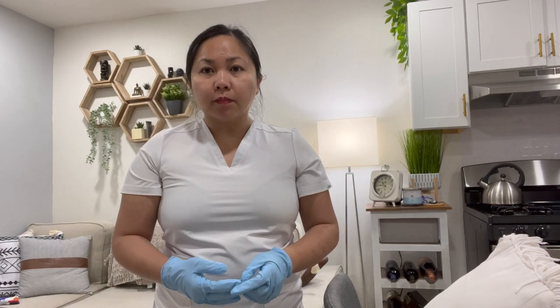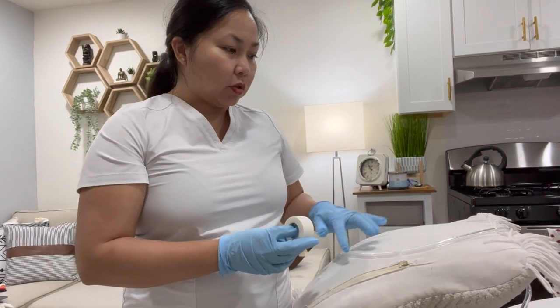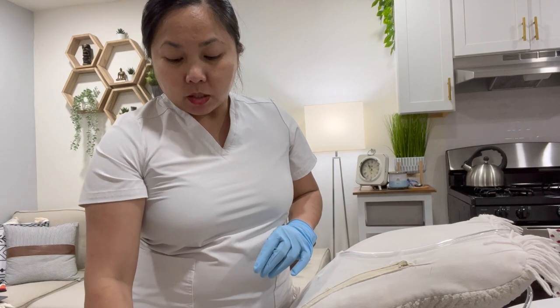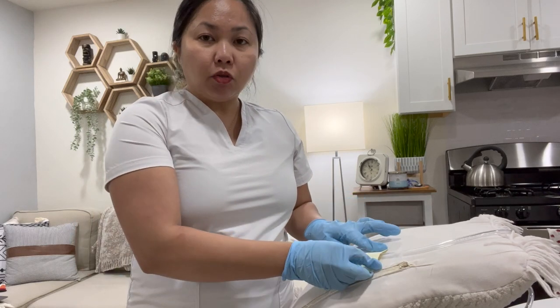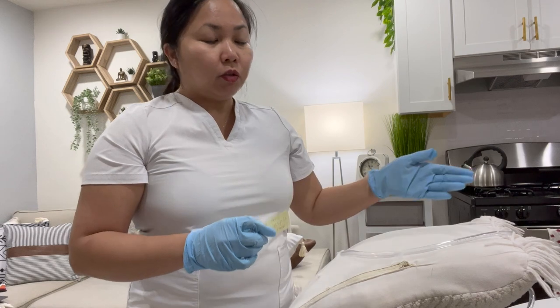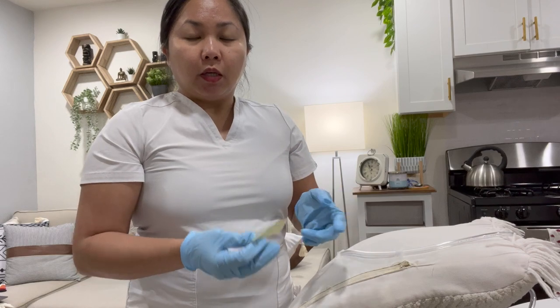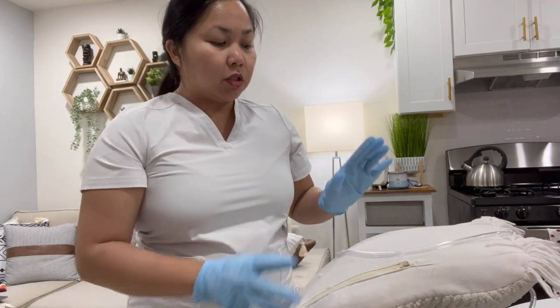Assuming this is my patient, get your tape and tape all the connections of the tubing so it doesn't get disconnected or dislodged even if the patient moves. Tape all the necessary connections and then get your label. The label should say 'For epidural infusion use only.' Wrap it around the tubing and label all the connections. That way there's no confusion — no other medications should be put on this line unless indicated by the responsible anesthesiologist.